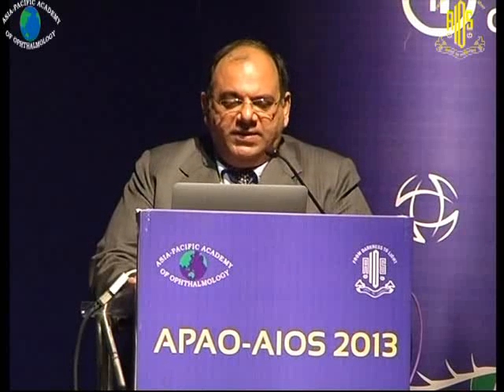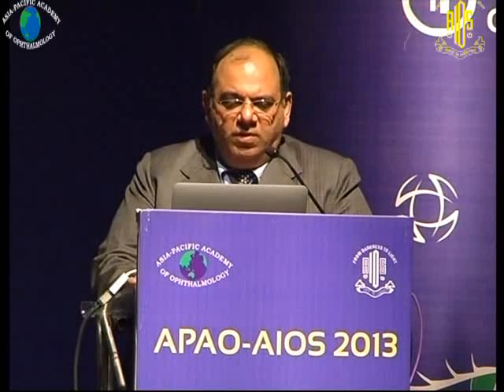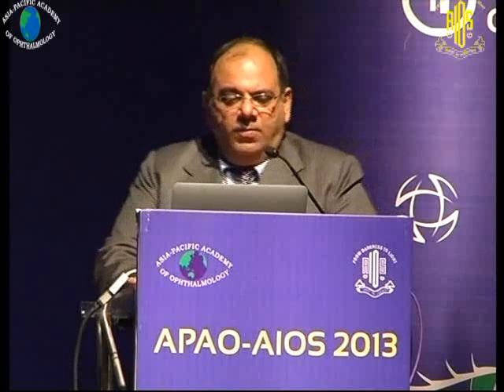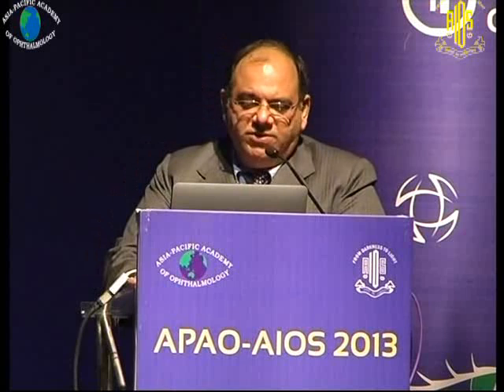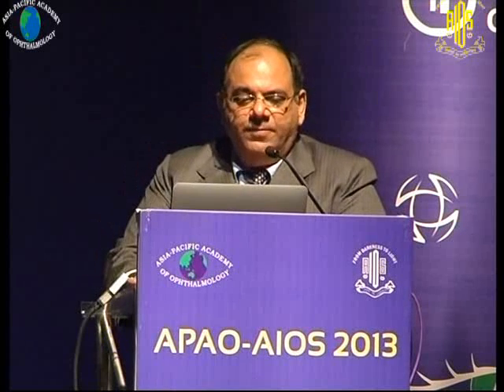Acrylic foldable implants are the norm. A suture may be used to stabilize during vitrectomy. The normal viewing systems are the wide angles which we use, and we just change to lenses for some procedures in the macular area.